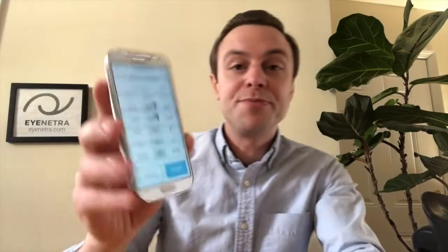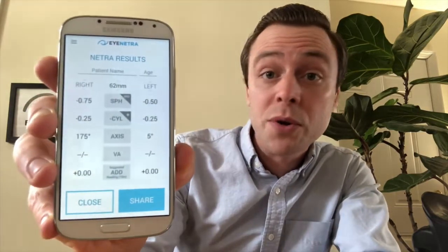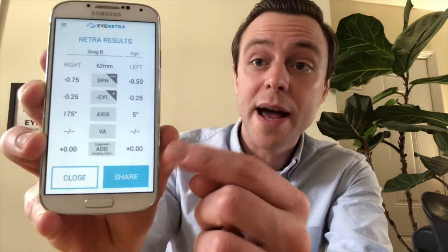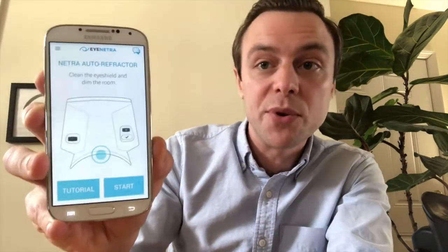To view the results, all I need to do is remove the phone and we'll see our measurement listed right here on the face of the phone. As soon as you get the results, the first thing you'll want to do is tag them with a patient ID so you know who they belong to. Simply tap on the line at the top where it says patient name and enter the name. In the field next to it for age, if you input the patient's birth date, it will suggest and add power for progressives or bifocals. Once finished, click close and everything will save automatically.